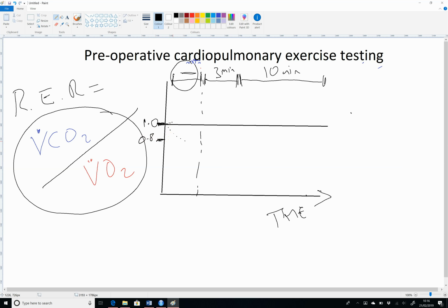They will change even during their aerobic period. Before the anaerobic threshold, they will gradually increase. So what we'd expect to see, let's get rid of those abnormal ones because we're concentrating on normality, aren't we? What we'd expect to see normally are dots down here. They'll tend to creep up a bit. That is normal. The anaerobic threshold has not been reached yet. And then they'll carry on going up to the end of the test here.